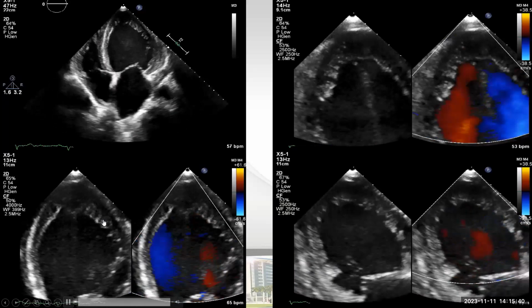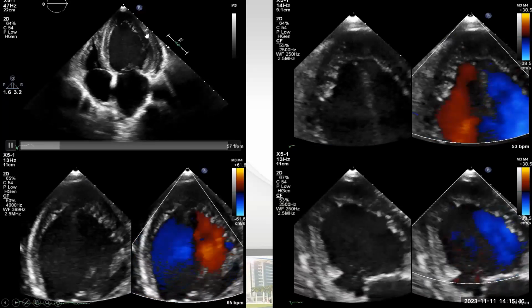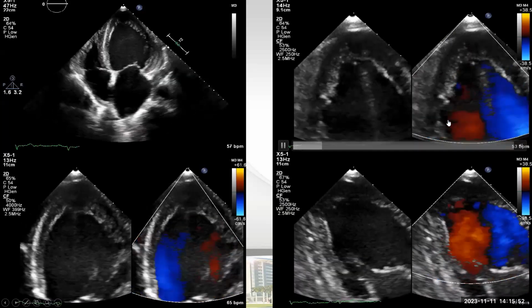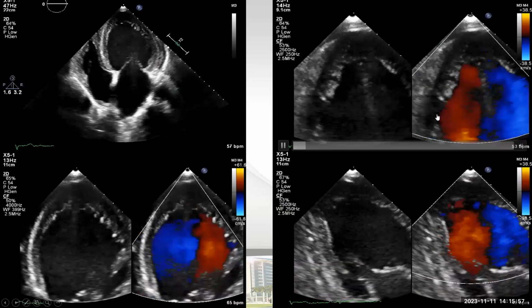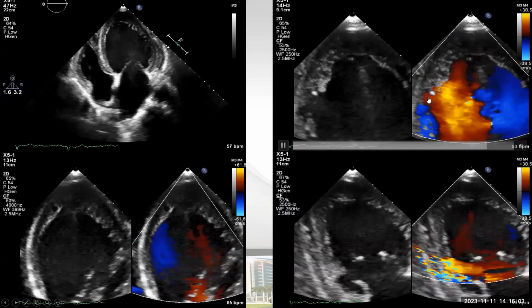Okay, so this is the most important. Heavy trabeculation in most of the LV segments, and usually it should start in the apex, then go to the lateral and other walls, as you see here. And once you put color, you can see that the color is integrated inside what we call these recesses. Somebody mentioned crypts, but the better name is just recesses.